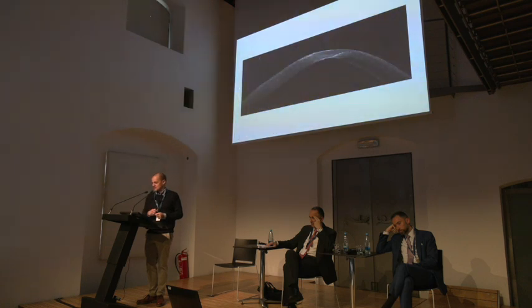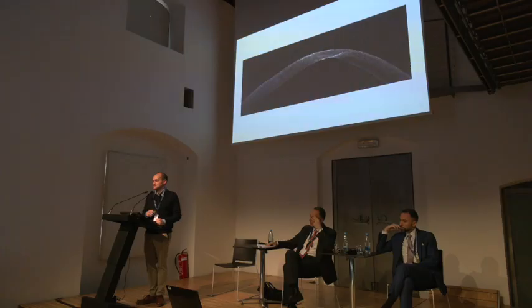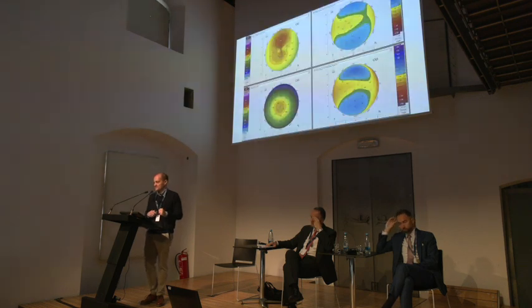Now, let's see another example. What happened to the other eye of this patient? Yeah, same problem. Horrible situation. He's being screened by a surgeon who has had a Pentacam for 15 years, being told that his cone is not progressing after CXL. And he came for a second opinion because his vision was dropping.